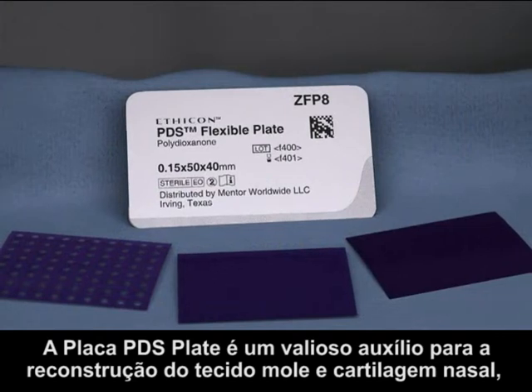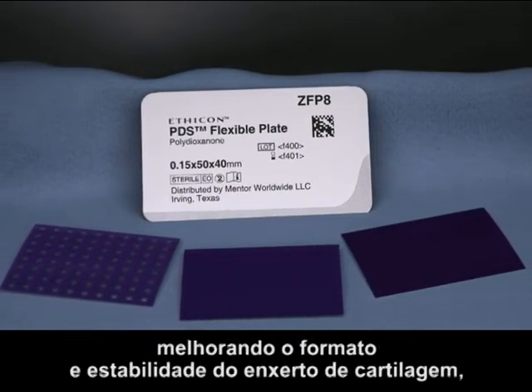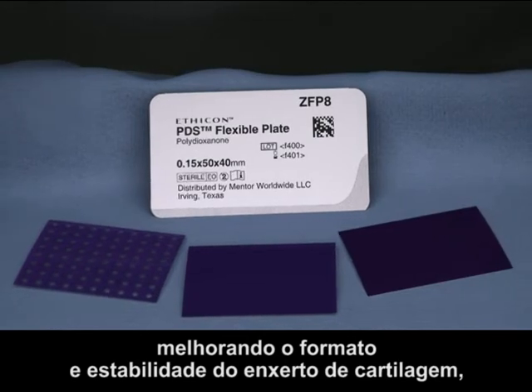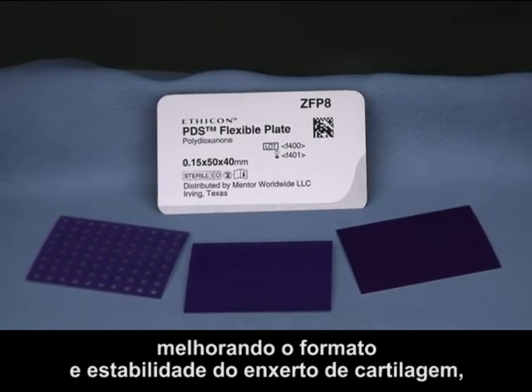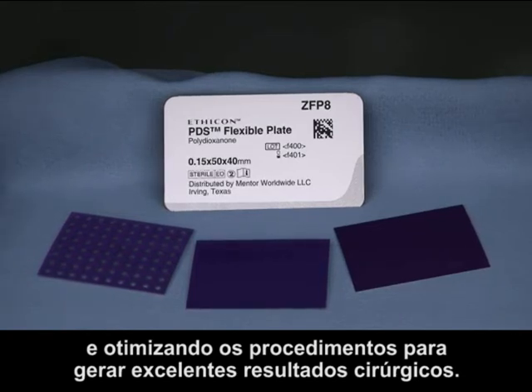PDS Flexible Plate — for nasal soft tissue and cartilage reconstruction, it's a valuable aid, improving cartilage graft shaping and stability while streamlining procedures to create excellent surgical outcomes.